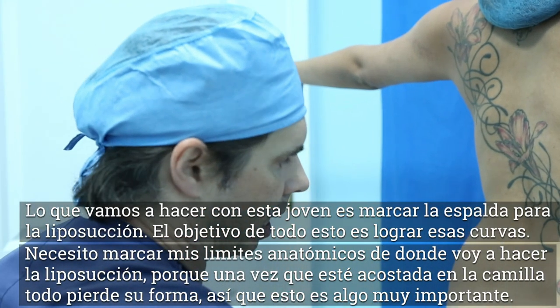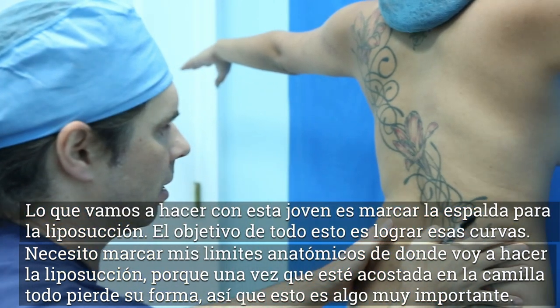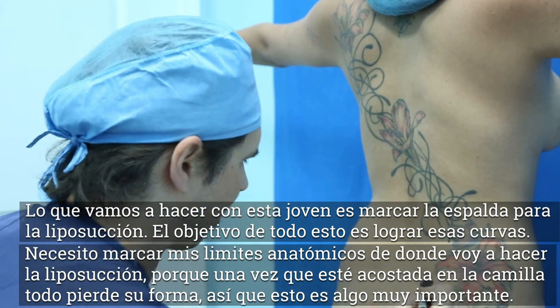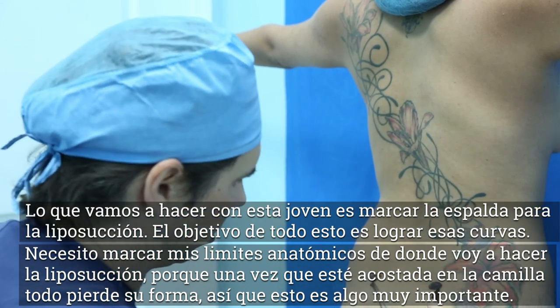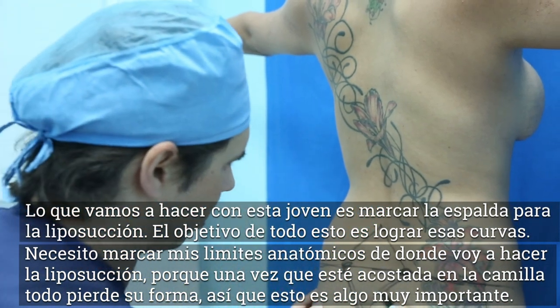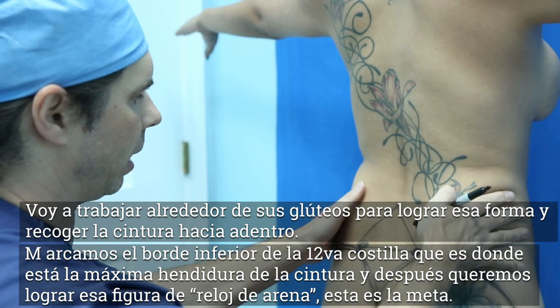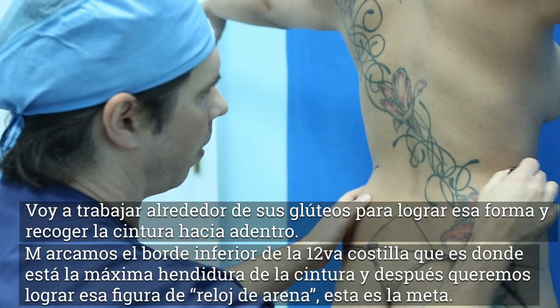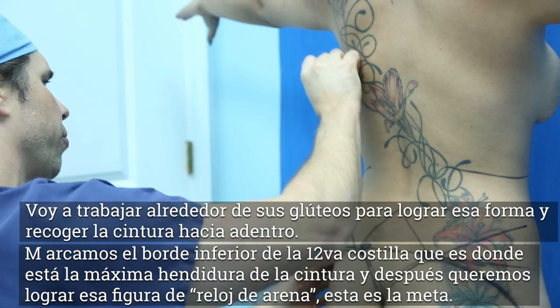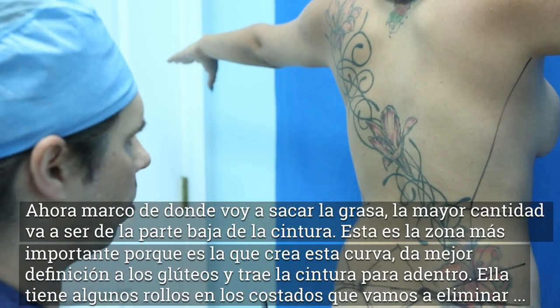Right now I'm marking up the back. The goal is everybody wants to get that waistline to come in like this, get that curve. Typically what I'm doing is marking my anatomical boundaries of where I'm going to do the liposuction — so once she's laying on the table and everything loses its anatomy, these marks are very important. I'm carving around the buttocks to really get that shape, bringing it in. I mark at the lower border of the twelfth rib, which is where that maximum indentation of the waist should go, and then we want to create that hourglass figure — something like that. That's the goal.